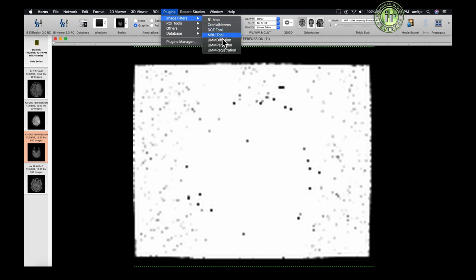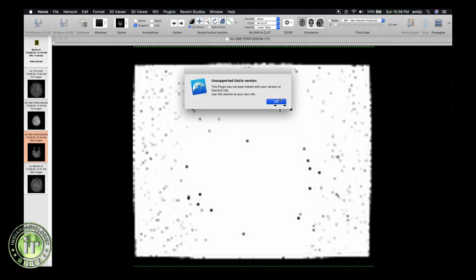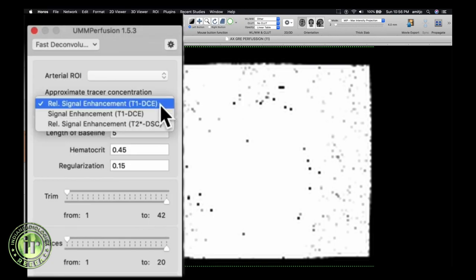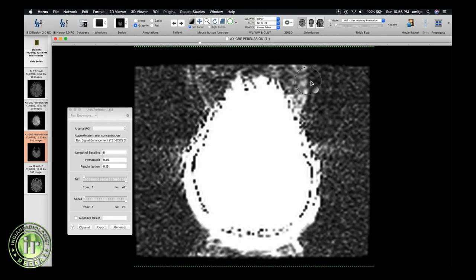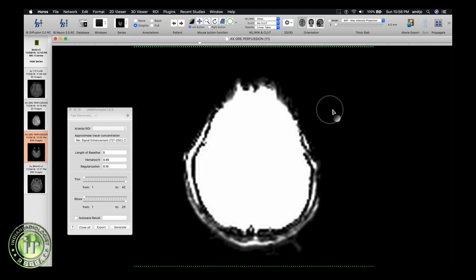Select the open source UMM Perfusion plugin. It will warn you about its open source nature and that it is not certified for clinical use. Select fast deconvolution, then select signal enhancement T2-star DSC. Change the window settings as required.